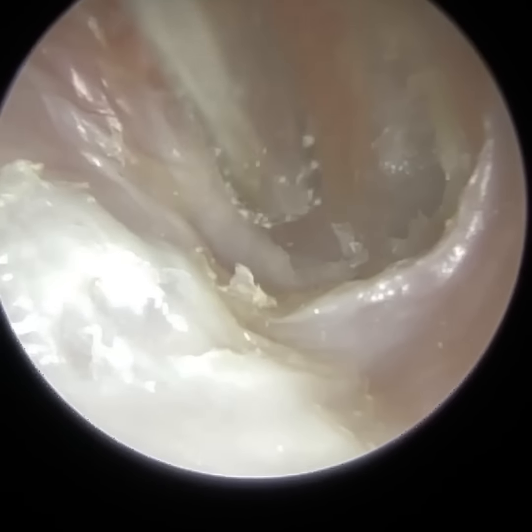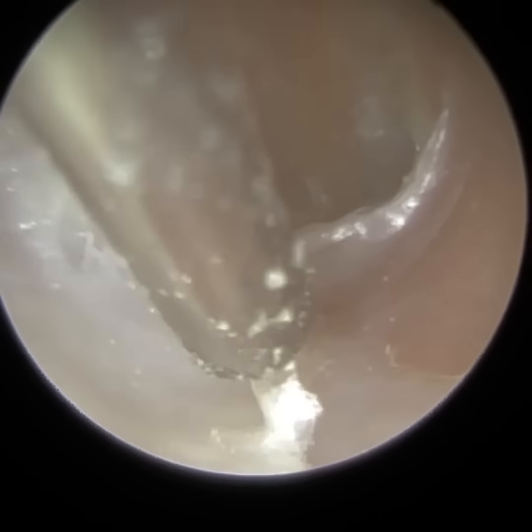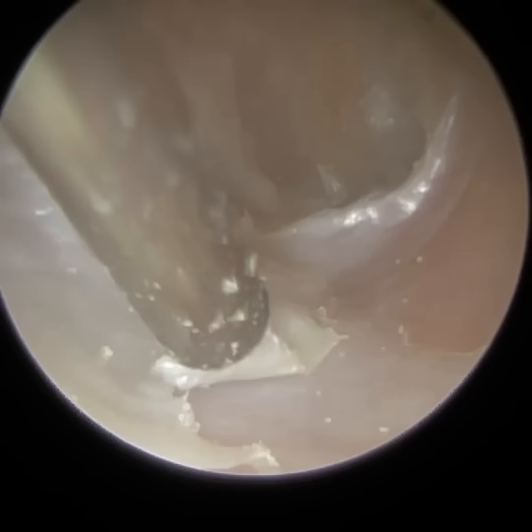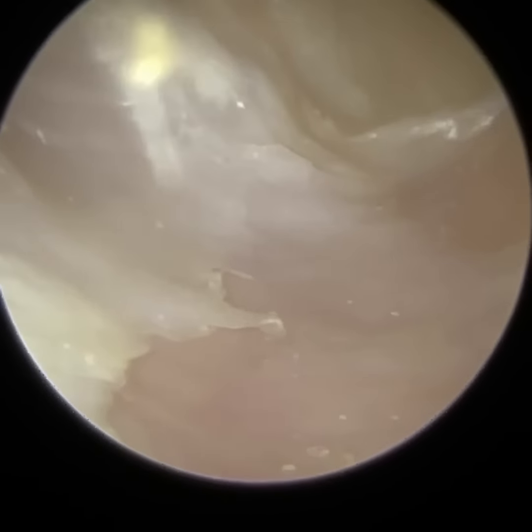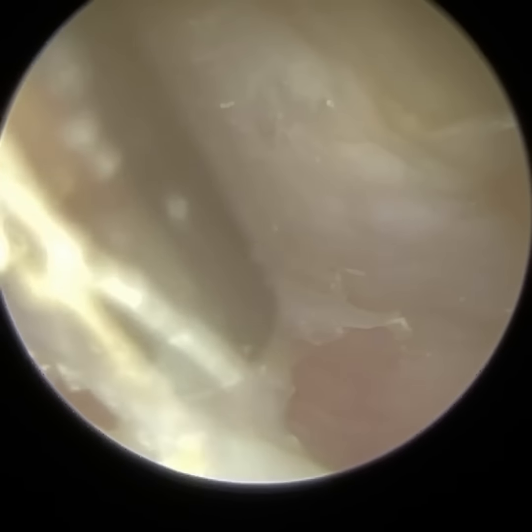So you can see the majority of the eardrum, but you've got this very thick layer of skin here, and I just want to peel away as much as I can. If I can give this patient an extra month of not having to come back, because it is chronic for them, I'll try and do that. But it is very difficult to peel all this away, because we're literally just hovering over the bone. And it's not even hovering. Sometimes when you hover, the skin comes away and you can peel it, but here I'm having to go so close to the surface of the bone.